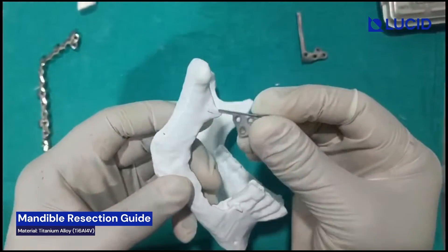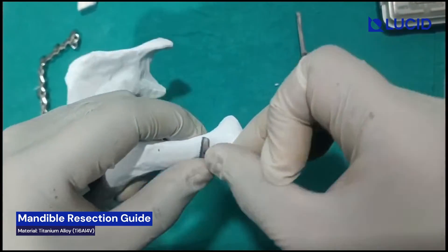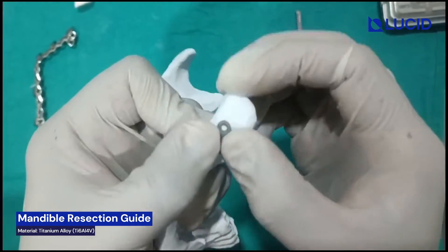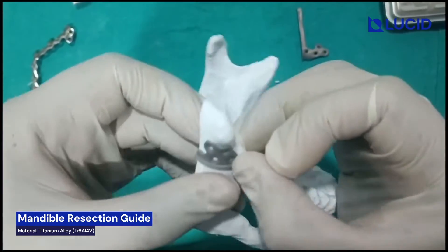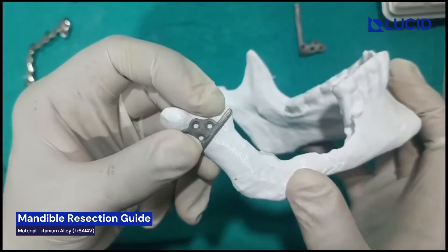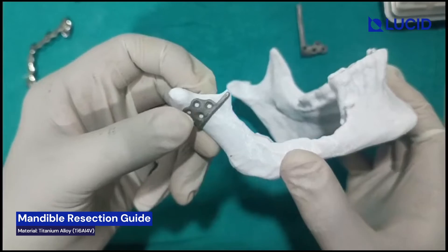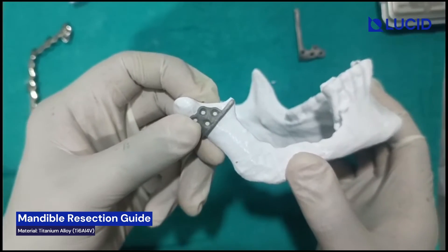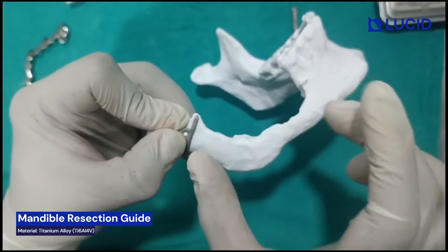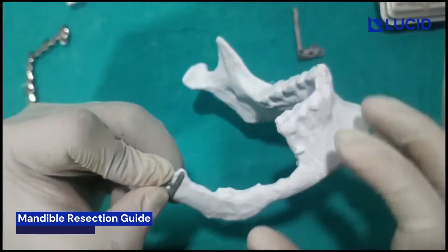This is the second guide and this will be placed in this fashion. Again you have to use 2mm screws to fix this guide, length 6mm. Again you can use any one or two screws to fix the guide and do this resection. After this, this much amount of bone will go off.